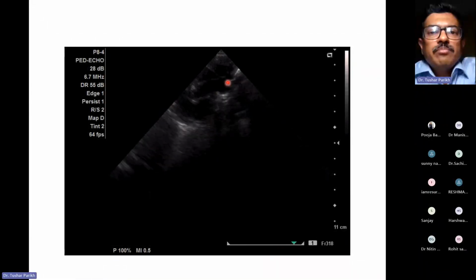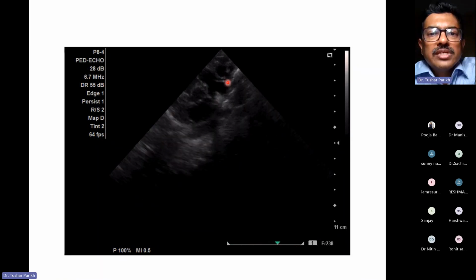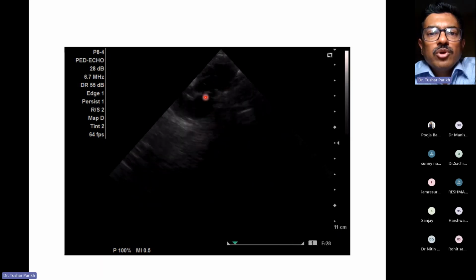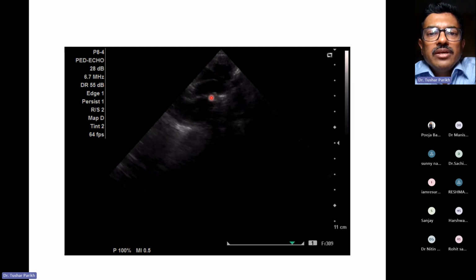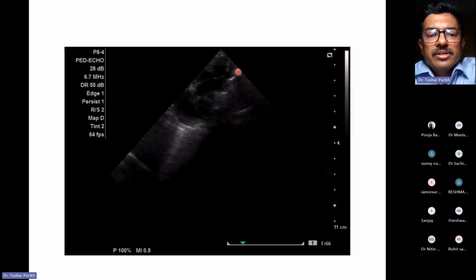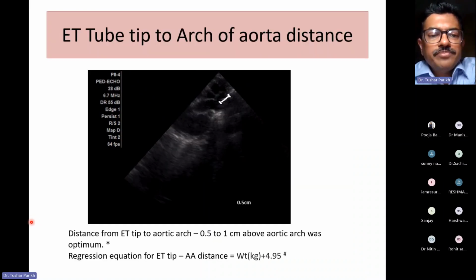If you are measuring from upper surface of arch of aorta, distance allowed is 0.5 to 1 centimeter. And if you are measuring from lower border of arch of aorta or upper border of LPA, the distance is 1 to 1.5 centimeter. Now people have done studies and they have tried to correlate with the weight of the baby.